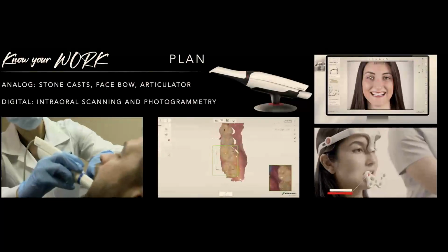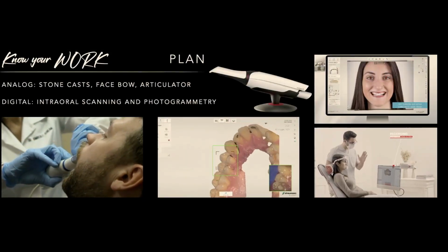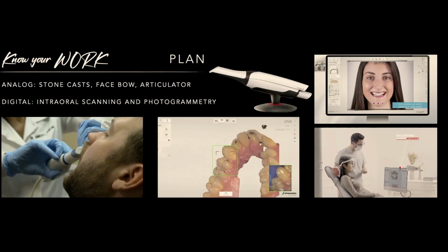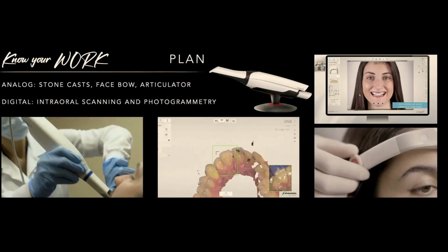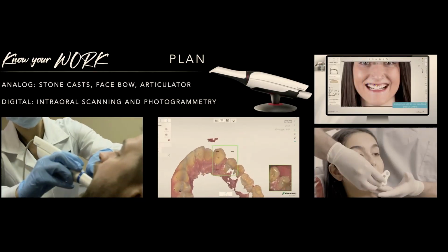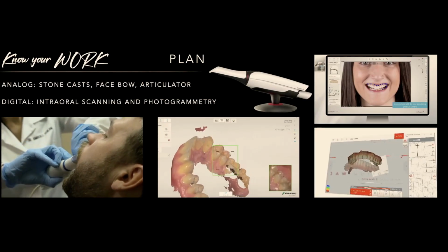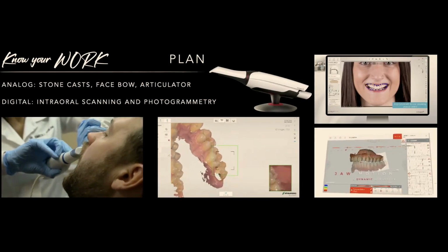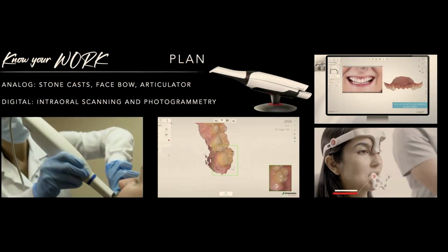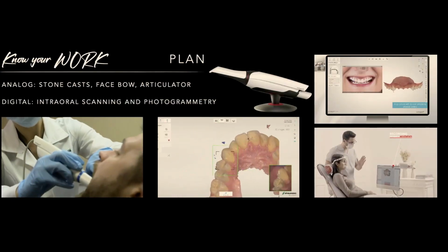So just showing a couple videos of some of the tools that you can use digitally. You can capture this information analog, right? You can get some alginate impressions, you can get some study models, you can mount them on a classic articulator, or you can do some of these things. I believe ModJaw is at the vendor, so you can check that out. That's also using photogrammetry. Some people might not realize that, but it's actually doing a recording of the jaw, so that's that lower video right there.